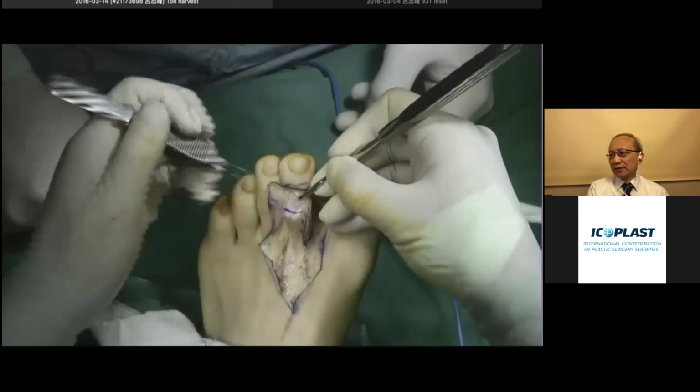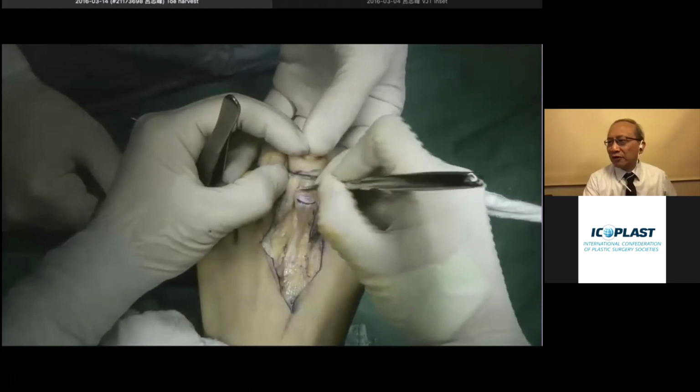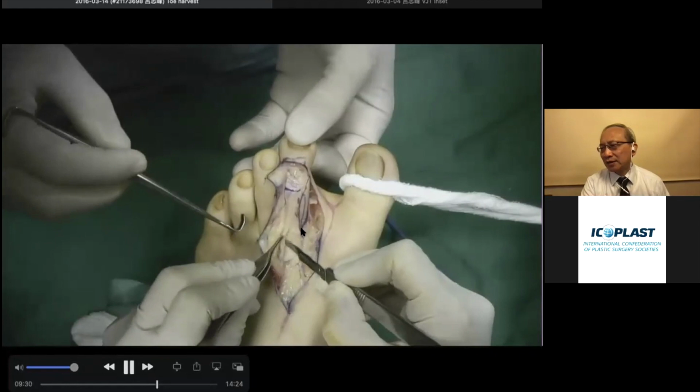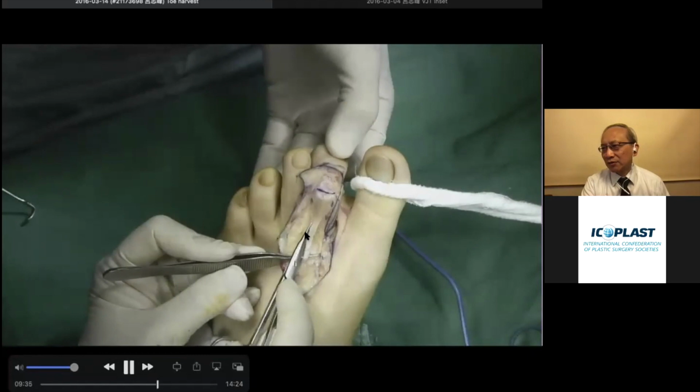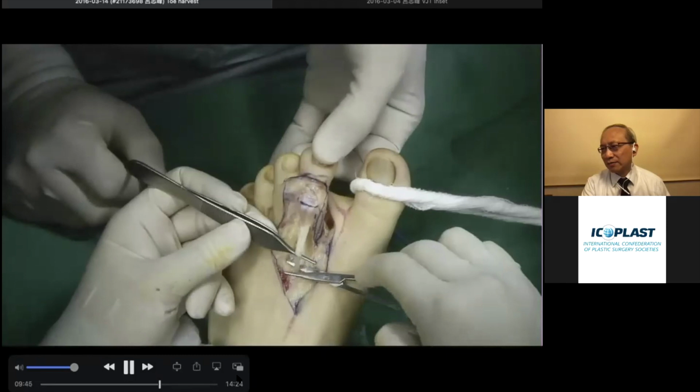So dissect a little bit of the periosteum, not too much, not all the way to the PIP joint, just long enough for the osteotomy. And I'm dissecting the EDL tendon from the sagittal sling on the tibial side, and the EDB tendon is over here, so we just preserve the EDB tendon for the toe. Dissect the tendon as far as possible, then cut the EDL tendon.